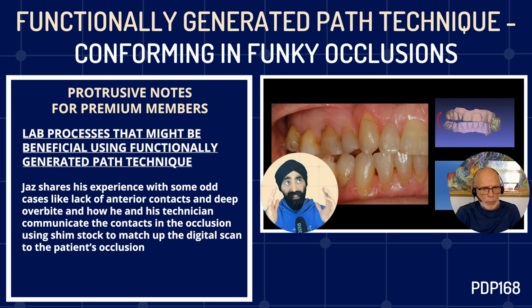But he tells me all the time that with digital, it's not quite there yet, and you do get funny occlusions. And if you go back to your old cases that were scanned and have a close study of the occlusion, you'll find that there are instances where funnier occlusions are not representative of what we have in the mouth. So therefore, for single unit cases, and I'll ask you, Tom, in terms of the technique you're going to describe, how many units can you restore using this technique?